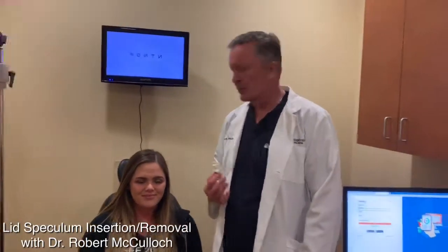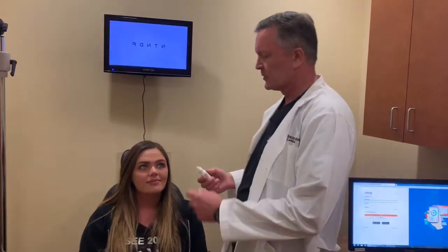Hi, this is Dr. McCulloch here, and this is Brooklyn. I'm going to demonstrate the proper way to put a lid speculum in to keep a person's eyes open. We're going to do the left eye then the right eye, all from one side of the chair, to give an idea how that's done.